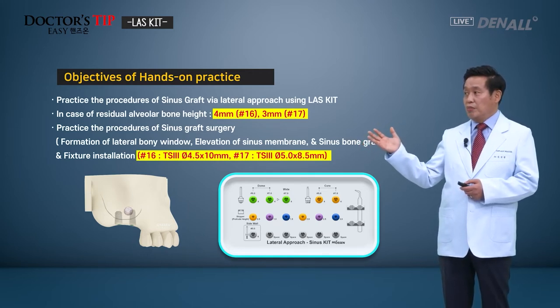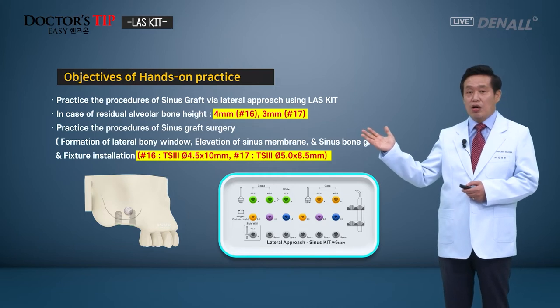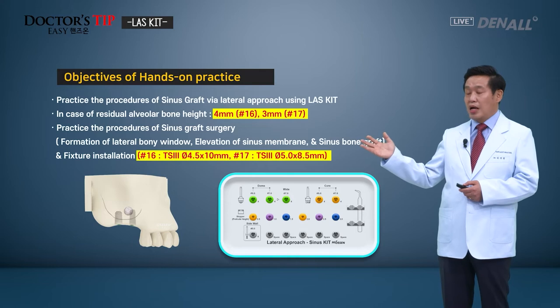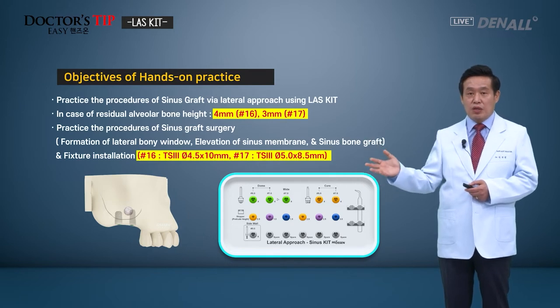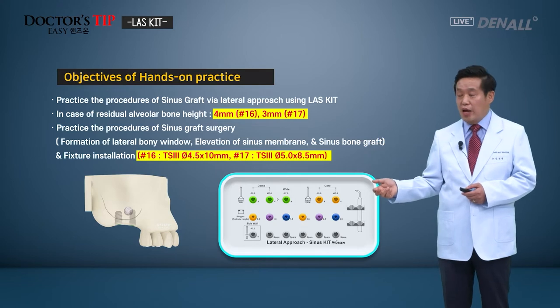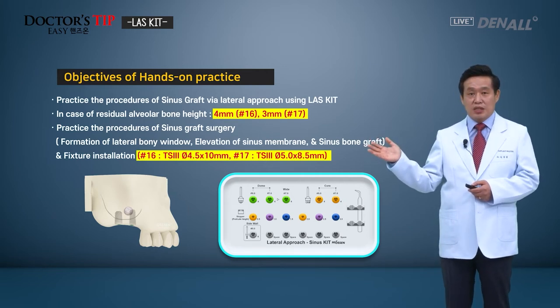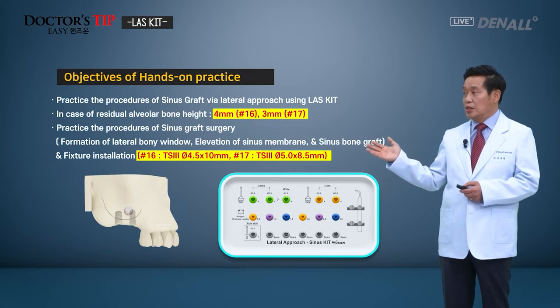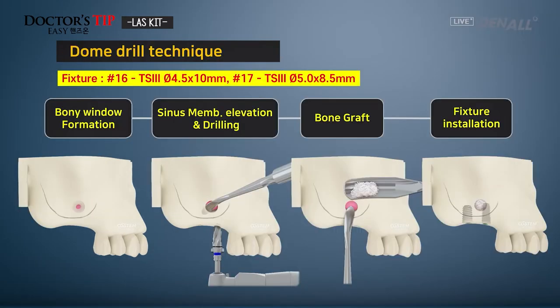In the mock-up that we prepared, the residual bone height with numbers 16 and 17 missing is 4 millimeters for number 16 and 3 millimeters for number 17. For these two teeth, using the dome and core drills, we will form the window, and then using the sinus kits, you will use the instruments to elevate the sinus membrane, do bone grafting, and place the implant. For number 16, we will use a TS 4.5 by 10 millimeter implant, and for number 17, we will use a 5.0 by 8.5 millimeter length implant. Using the dome drill, we first create the bony window, and then with the wide drill, we expand further, do sinus membrane elevation, bone grafting, and place the implant.